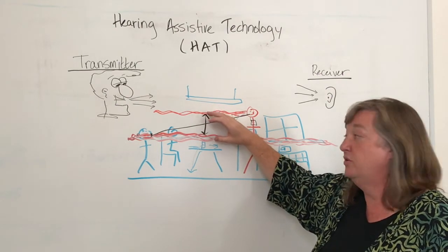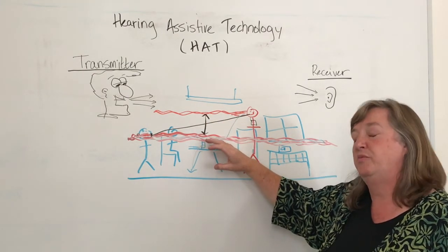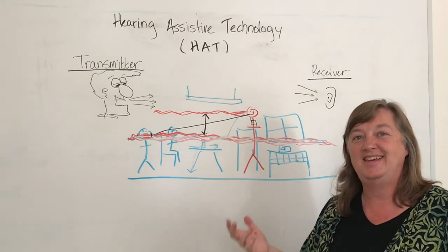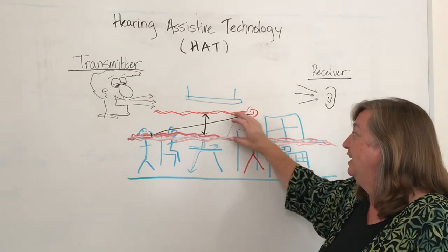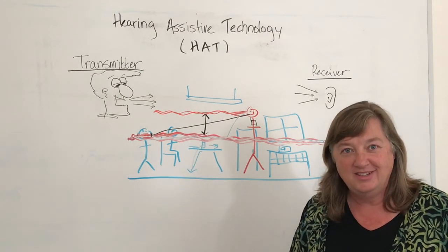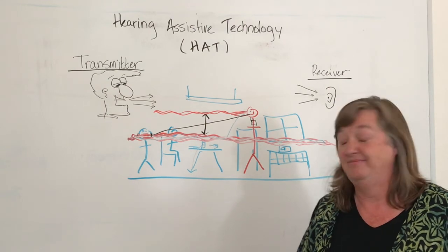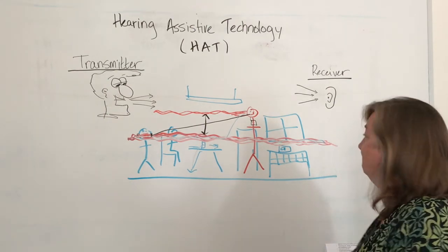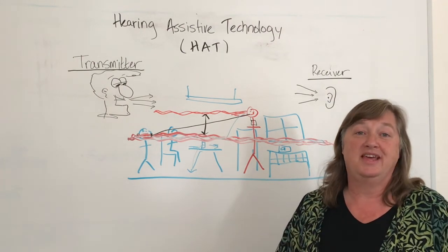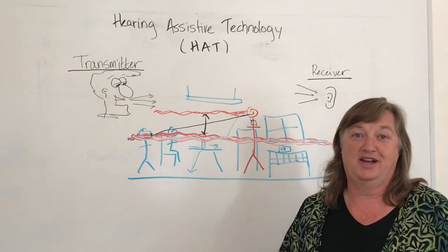And as the background noise gets softer, it will bring the background noise down softer, maintaining a steady gap in signal so that your student is going to know where to pay attention to and what is the pertinent information. And that's it. I will then send you some information about different kinds of transmitters and different kinds of receivers.